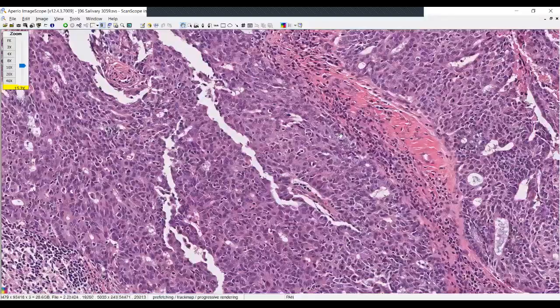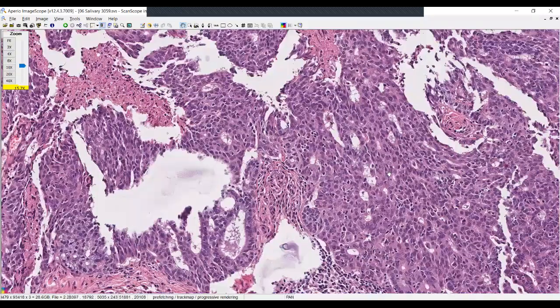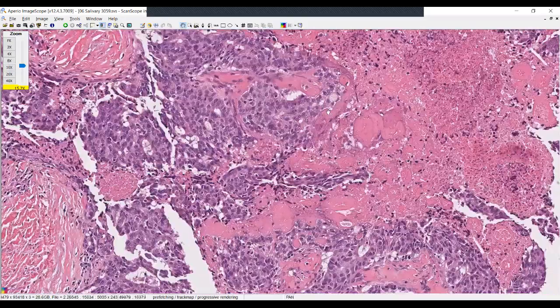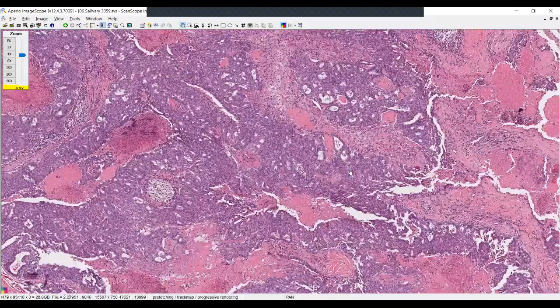So acinic cell carcinoma, as you know, can undergo high-grade transformation. One of the stains that can be used to confirm the diagnosis is DOG1. DOG1 is usually positive in these cases. Unfortunately, it's not usually maintained in the areas of high-grade transformation. However, that is usually not difficult, because when you see the areas of high-grade transformation, that probably is what you would have focused on initially, and therefore maybe been a little bit misled about the diagnosis.